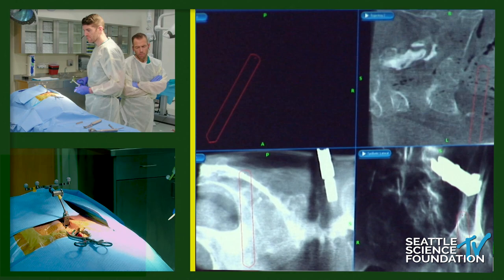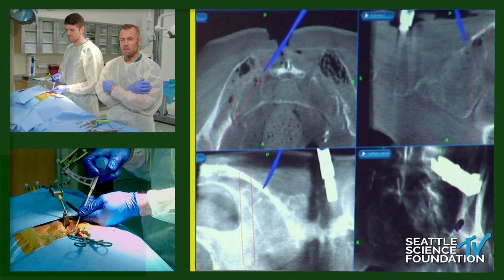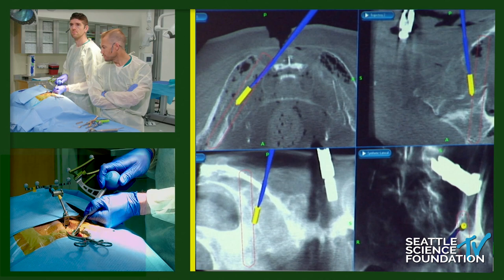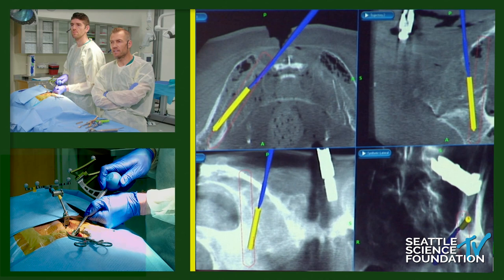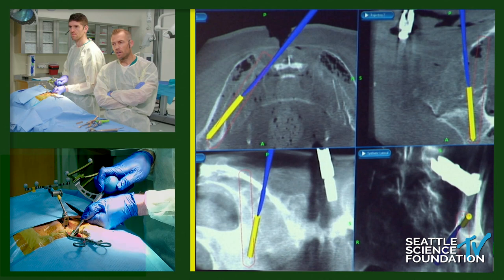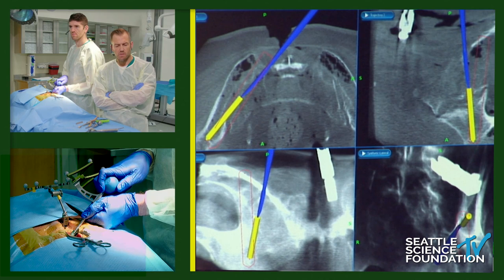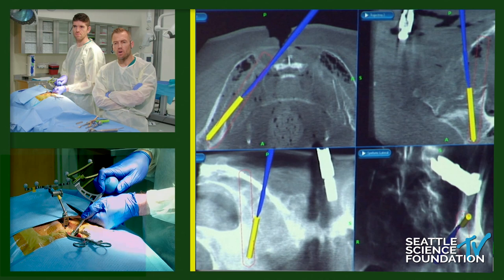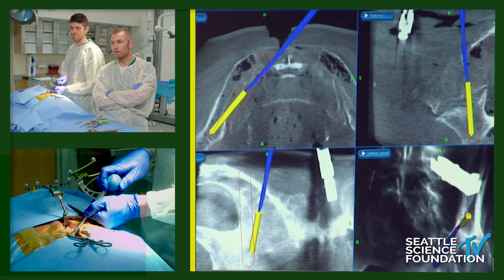I've saved enough real estate for Jared to place the device above — it's acceptable for the devices to converge so long as the starting points are separate. Jared is now coming in. The starting point for this more proximal device is just lateral to the S1 neural foramen. We're maximizing sacral bone included in the passage of this device while staying appropriately proximal to the sciatic notch. The start point at S1 necessitates a steeper, more posterior-to-anterior approach than our first device in the S2 alar bone.